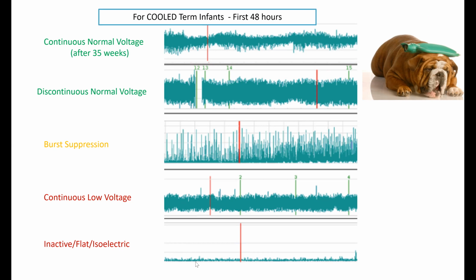Yes, yeah. Okay. I don't remember what your question was. Something about Versed? Someone was asking what you would expect to see. It's been a while since I've been in that realm. I'm an EEG tech for 30 plus years, but getting back into this with the aEEG trending now, I would expect suppression. I don't know what you give now to put your babies into a medically induced coma, and if you do that during this time. Do you put them into burst suppression in the first 72 hours on purpose? Not typically, but I've seen it for status epilepticus, Versed drips. Okay, and for sure.